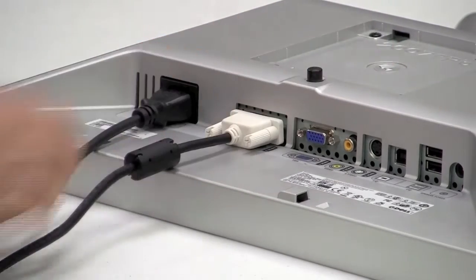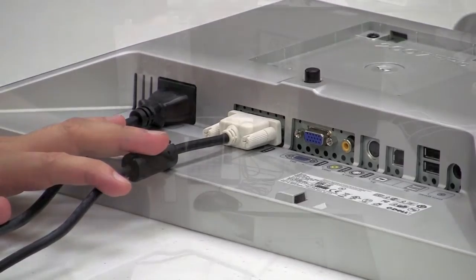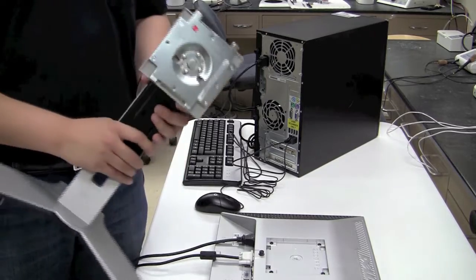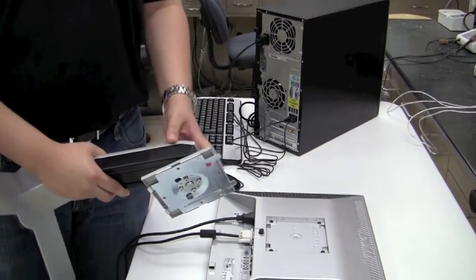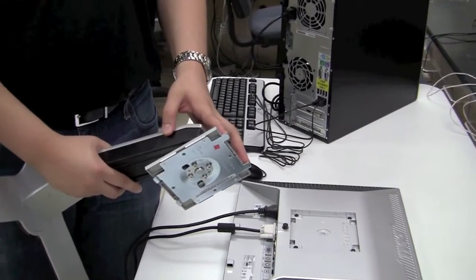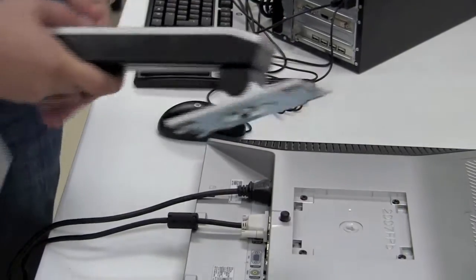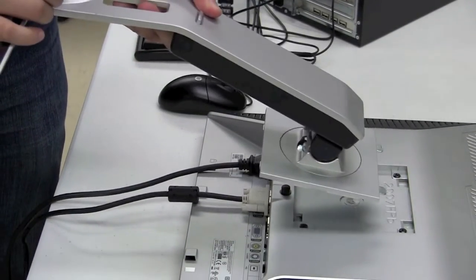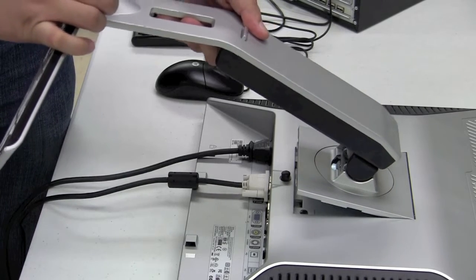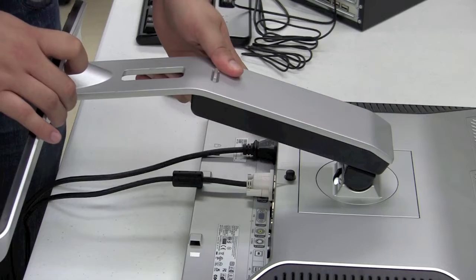Once those items are secured, we're going to mount the base of the monitor onto the back. On the base where it mounts, you'll notice two small tabs, and there are two corresponding slots on the top of the monitor back. Simply slide those tabs into the slots at an angle, then drop the base and it'll snap into place.